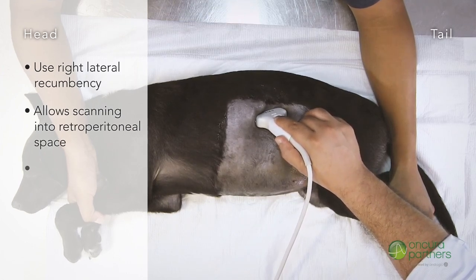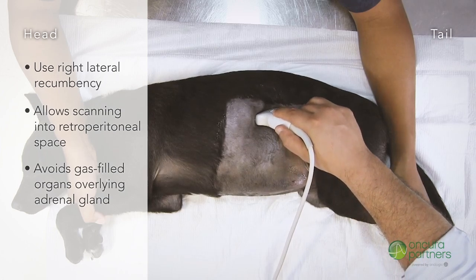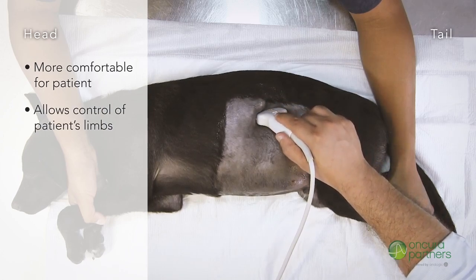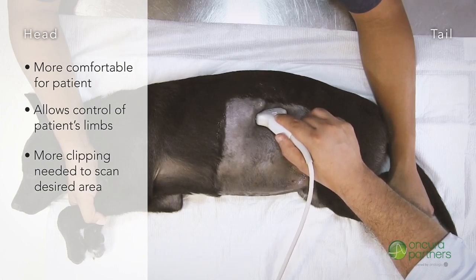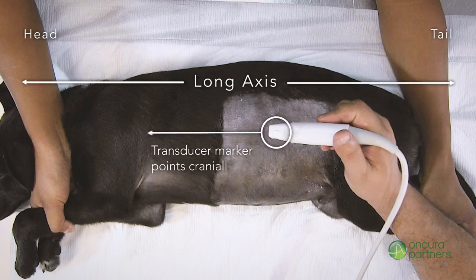Secondly, it will help to avoid the gas-filled colon, small intestine, and splenic body, which overlies and can interfere with the visualization of the left adrenal gland. Thirdly, this position seems to be more comfortable to patients and only requires one person to hold the dog. It should be noted, however, that more clipping will be needed to reach the desired area, something to consider when speaking to pet owners. To begin in the long axis, point the transducer marker towards the patient's head.